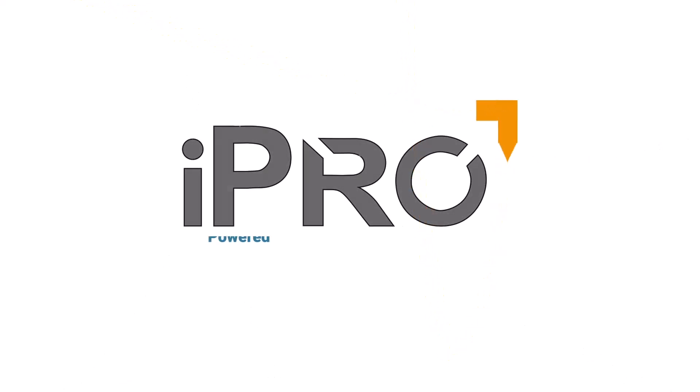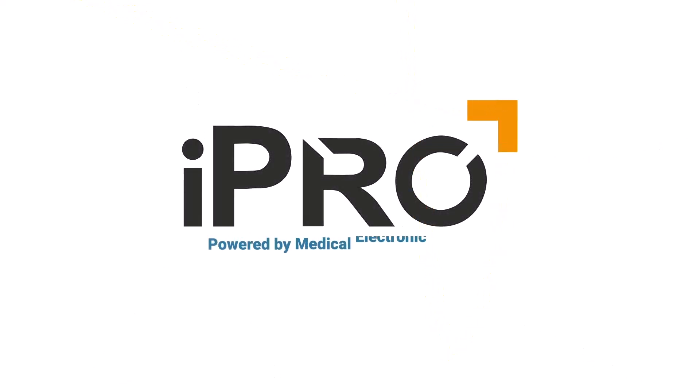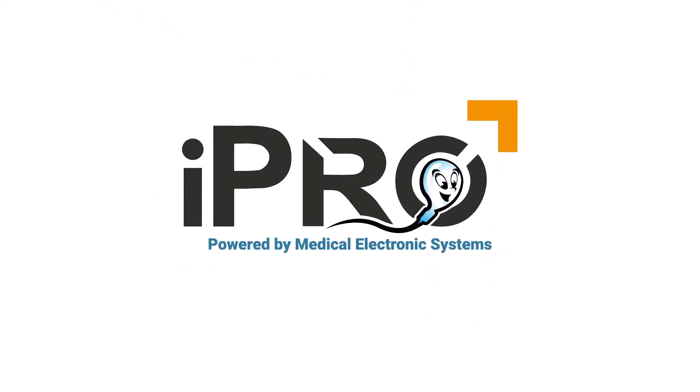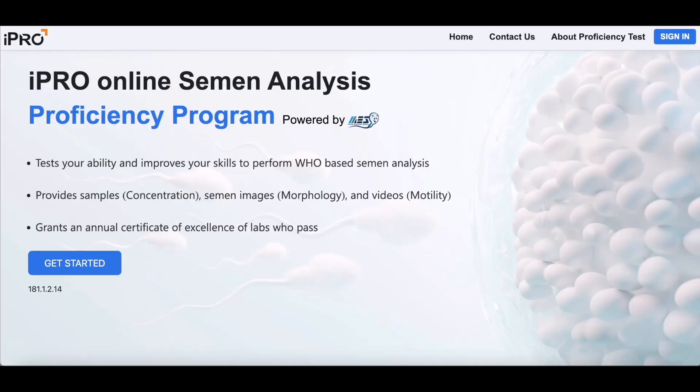Welcome to the iPRO Proficiency Challenge, powered by Medical Electronic Systems. The iPRO Challenge tests how you perform WHO semen analysis in your laboratory.